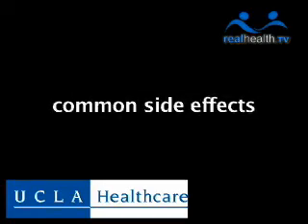The rest of the procedure really doesn't have that pressure feeling on the eye. That lasts for about 30 seconds. The rest of the procedure involves some rinsing of the eye with fluid and the patient watching a red flashing light during the actual laser part of the procedure. It's a very benign procedure to go through in the sense that the patients don't feel anything sharp on the eye. The pressure is really the main aspect that's a little uncomfortable. The procedure itself takes about a half an hour to do both eyes.